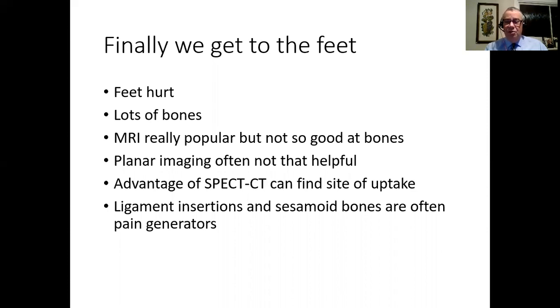So, for example, they used to do MRs on the feet of professional soccer players, football players. And by the time they'd been a professional for 2 years, every single bone in their foot was positive on an MR scanner, but they didn't all have damage to their feet. It's just they get bone edema because of the repeated trauma. So it doesn't really tell you which one of those bones is the one which is causing the problem.